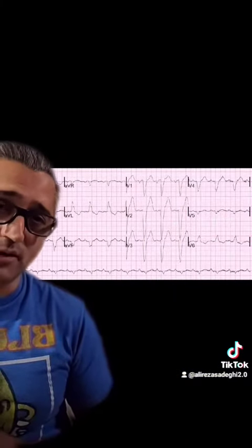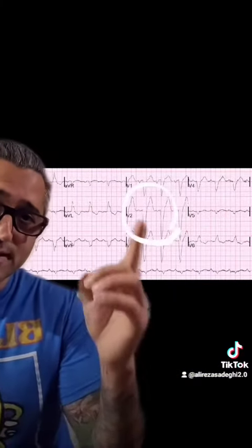Now, let's look at another example. But before we do, listen — elevation of 5mm or more should always be a reason for concern. This stands true for pericarditis, early repolarization, LVH, and left bundle branch block. So let's look at this one. Do I have elevation of 5mm or more? Yes, I do. That's all I need to know — Sgarbossa, or abnormal.